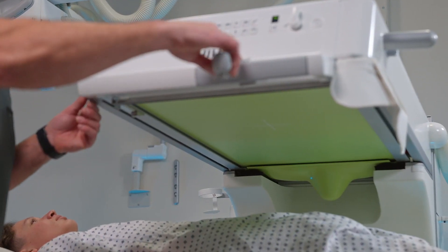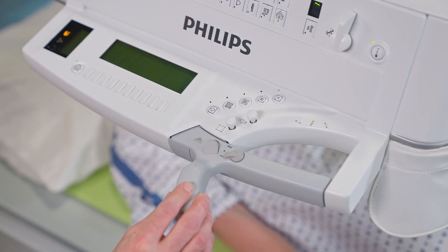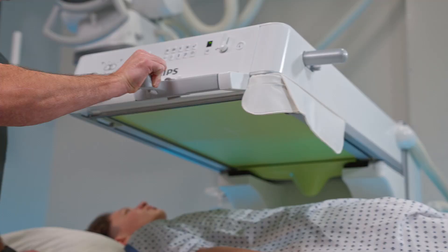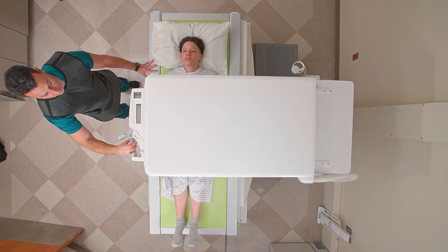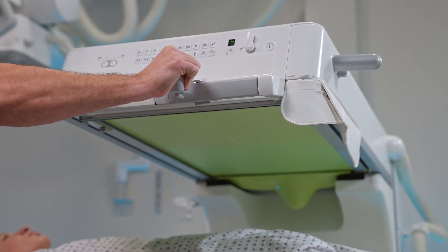When moving the tower, you have a motor assist handle. If you grab the handle — this gray area — you can easily move up and down head to toe. You can move side to side, and you can move in circular motions as well, so you can easily follow barium with the tower.